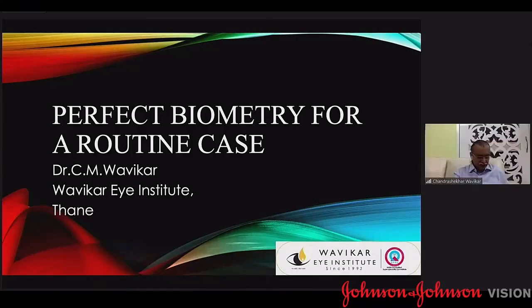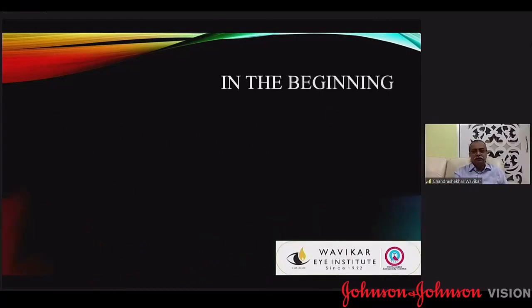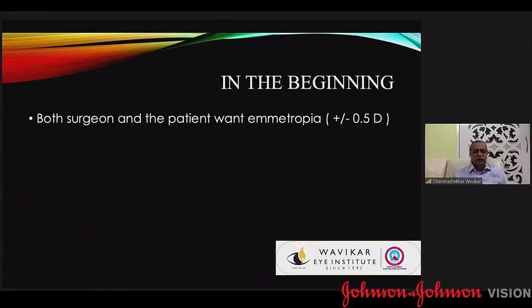Good evening and thank you. Let's start with the beginning. Today, both surgeon and patient want emmetropia. And there are too many variables in this. Our job, if we want a perfect biometry, is to reduce these variables.